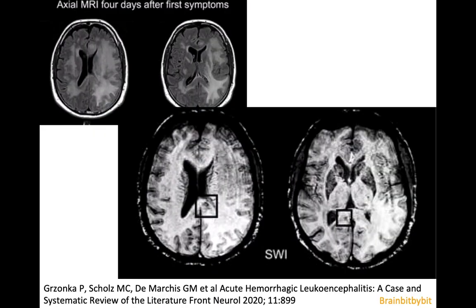The hemorrhages in this hemorrhagic variant are best detected on gradient and susceptibility weighted images, as you can see in the corpus callosum, and there are also hemorrhages in the leptomeninges in this patient. The cortex is usually relatively spared.